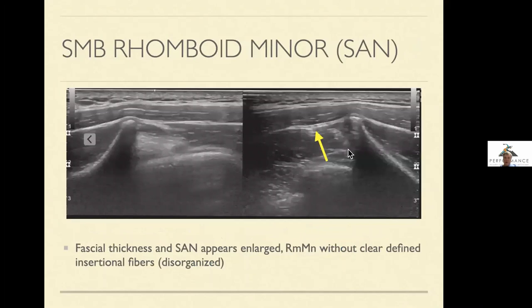Here's our patient. First, I'm doing the rhomboid minor portion of the scan with the windshield wiper component, and I see all these hypoechoic findings within that fascial layer. These are all swollen spinal accessory nerve fibers. You can see the contralateral side does not have those findings.